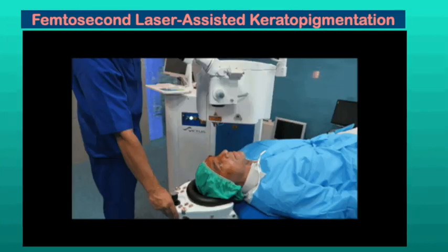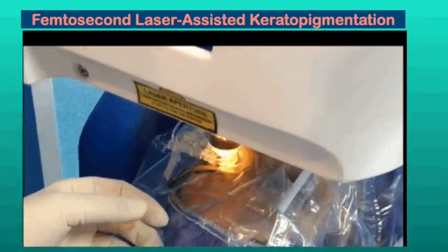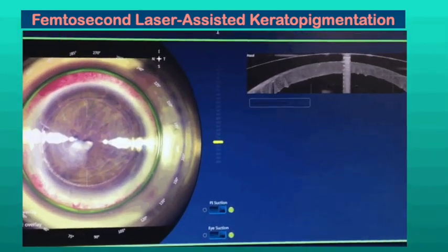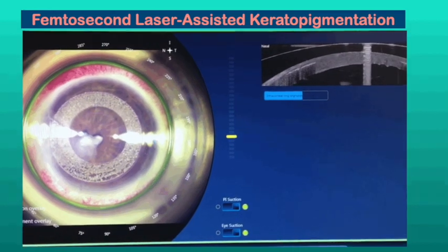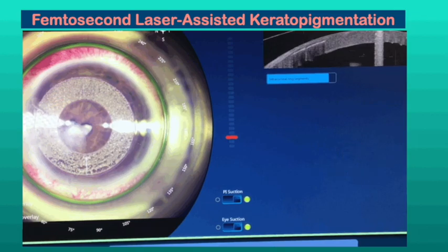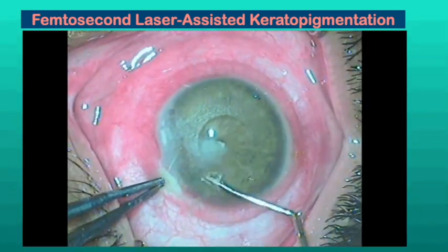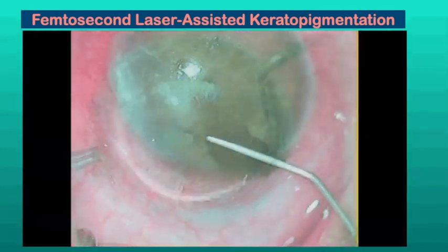In the femtosecond laser-assisted technique, a tunnel or partial pocket is created in the anterior corneal stroma with a depth of 220 to 250 microns, with sparing of the pupillary zone. For this purpose, the intracorneal ring program of the femto machine can be used. Two radial incisions are made for access into the tunnel. Then the tunnel is extended manually up to the periphery and dye is injected.